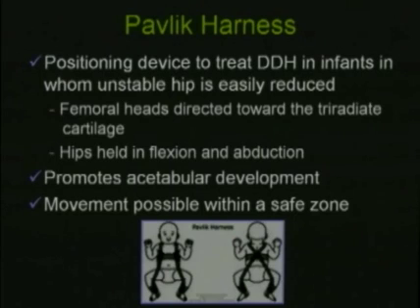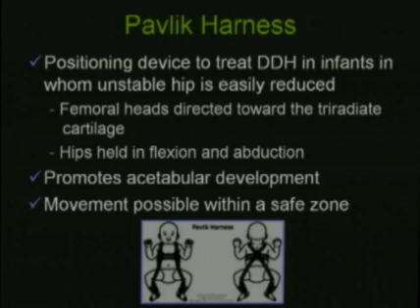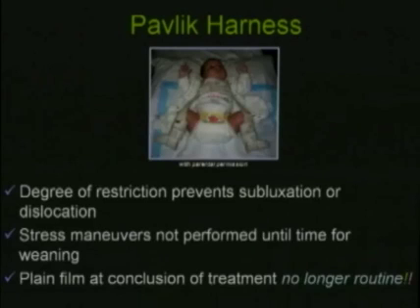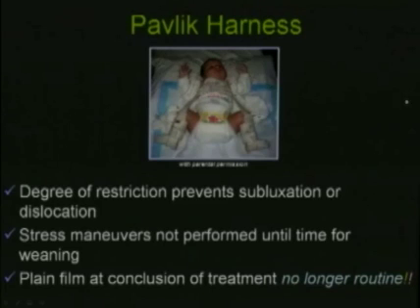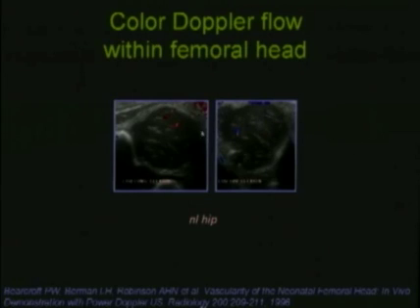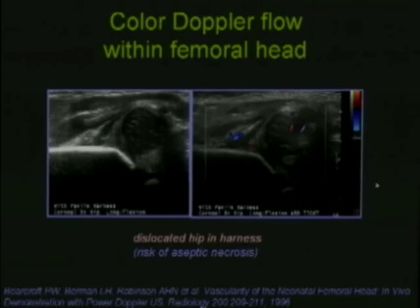For babies with an unstable but easily reducible hip, the Pavlik harness positioning device is used. The femoral heads are directed toward the triradiate cartilage with the hips held in flexion and abduction to promote acetabular development while allowing movement in a safe zone. Stress maneuvers are not performed until it is time for weaning. When the baby is in a harness, color flow Doppler images are obtained to monitor for aseptic necrosis — a known risk — confirming that color flow within the hip is preserved.